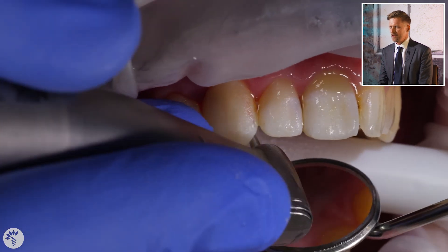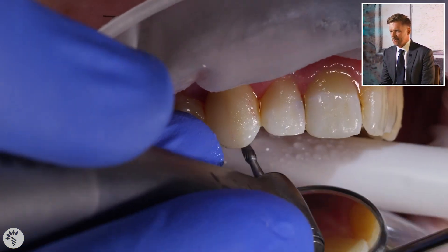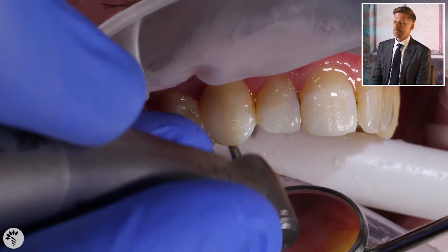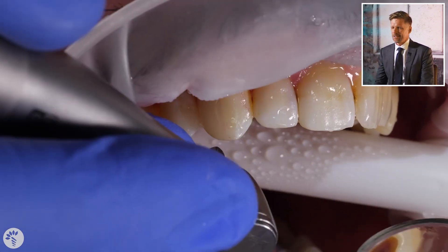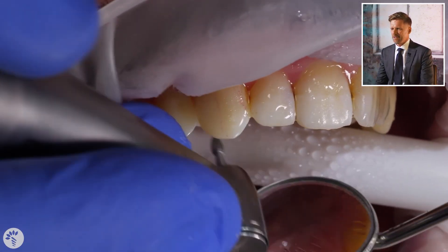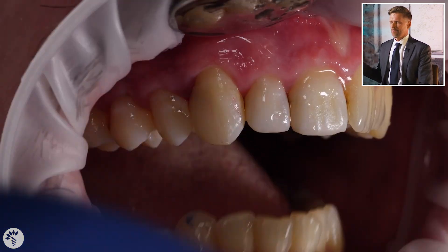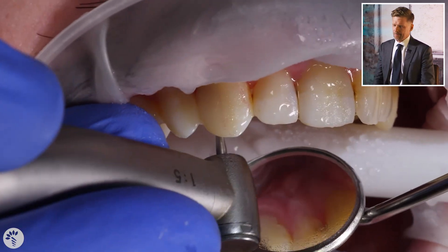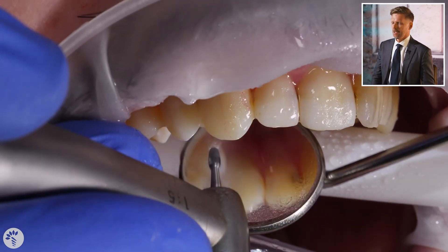Next, I'm smoothing the gingival margin. A lot of times we think the gingival margin must be smooth from the matrix — it does not. You can have a massive overhang and still make it smooth. Injection molding cases end up with massive overhangs and people make them smooth. But before bothering to make it smooth and pretty, we just want to make the bite good, because if we leave the bite high, the restoration will break, the patient will be unhappy, and it will possibly get sore.